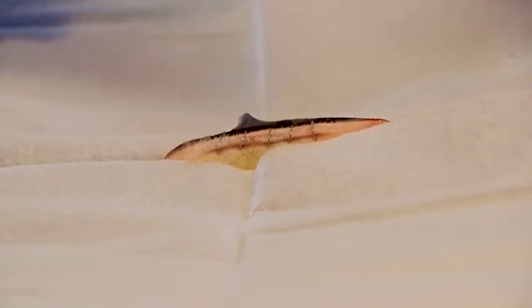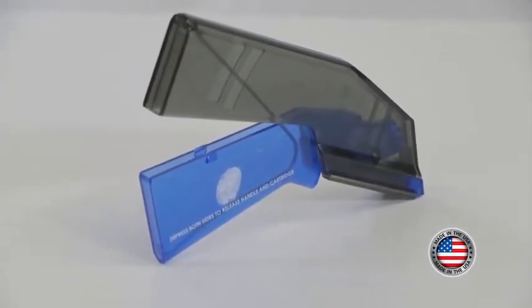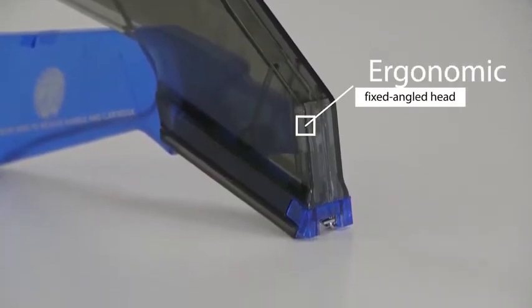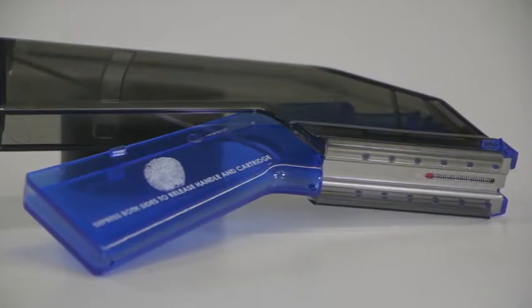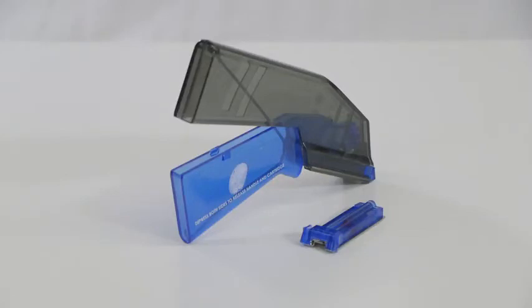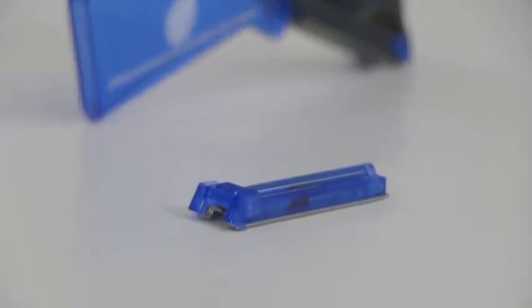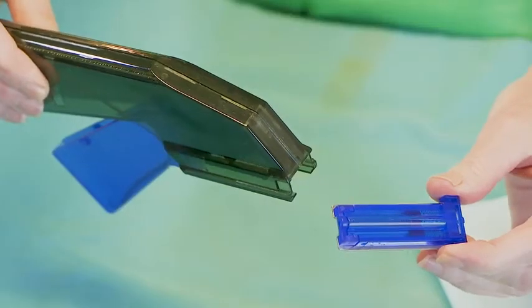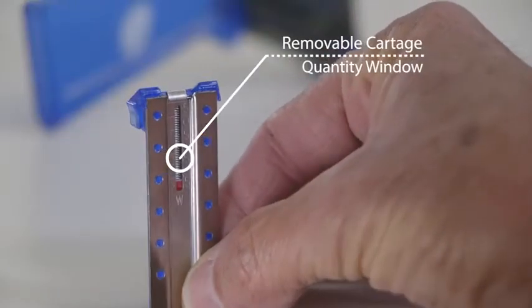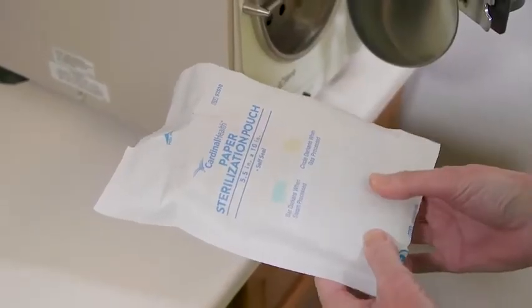The Jorvet stapler was designed with an ergonomic fixed-angle head, which allows for better visualization and more accurate staple placement. Another great feature is that it's environmentally friendly — other staplers are meant for one-time use, which is extremely wasteful. The Jorvet stapler uses a reloadable cartridge containing 35 stainless steel staples. The cartridge has an easy-to-read window so you always know how many staples remain.